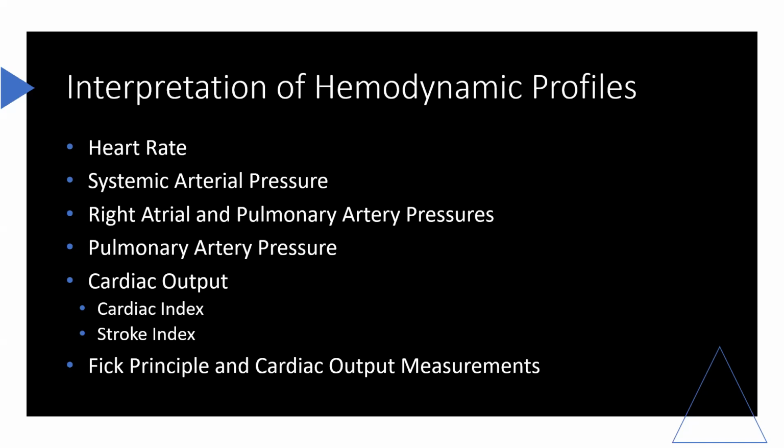Direct measurements of right ventricular pressures are usually only obtained during insertion of the catheter. Identification of the right ventricular pressure waveform during continuous monitoring indicates that the catheter has slipped into the right ventricle. It should be repositioned by reinflating the balloon and allowing the blood flow to carry the catheter back into the pulmonary artery. The balloon should be deflated once the catheter is repositioned in the pulmonary artery. As mentioned, the balloon should be inflated for short periods of time when measuring PAOP.